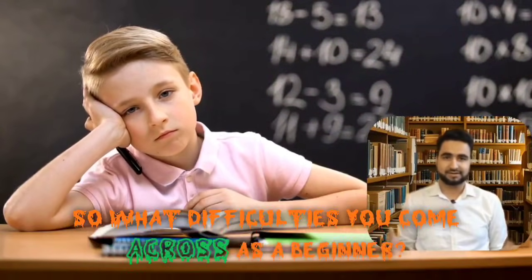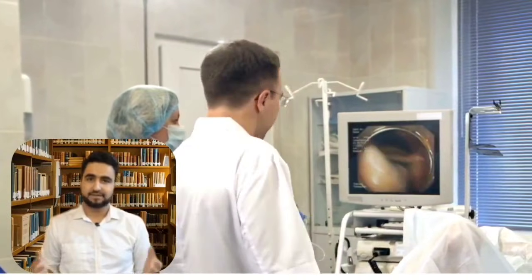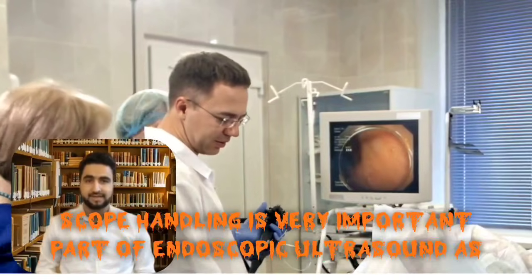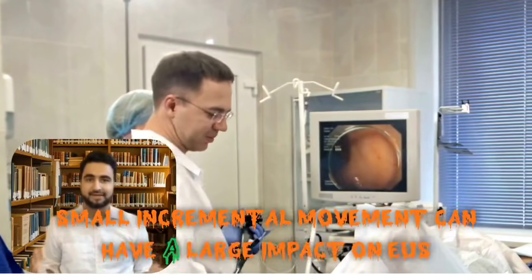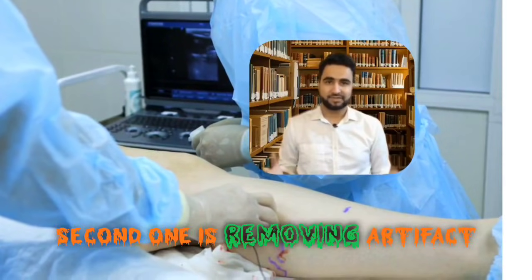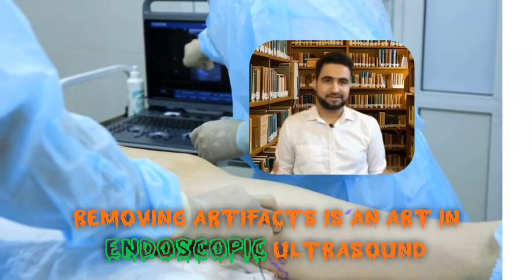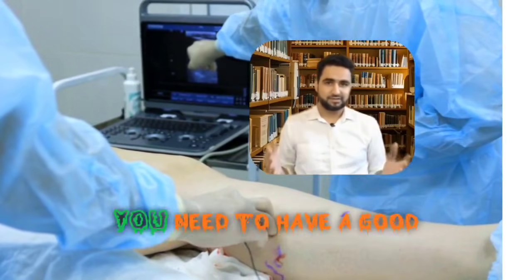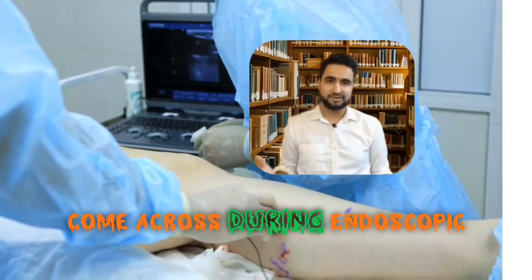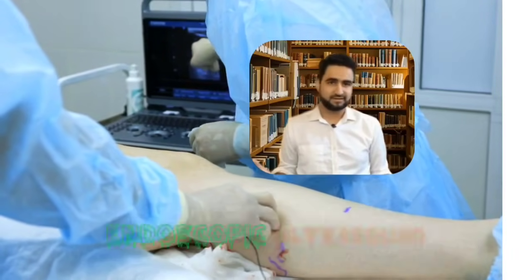What difficulties do you come across as a beginner? The first one is scope handling. Scope handling is a very important part of endoscopic ultrasound, as small incremental movements can have a large impact on the EUS image. The second difficulty is removing artifacts. Removing artifacts is an art in endoscopic ultrasound, and for learning this art you need a good knowledge of the artifacts you may encounter. There will be a separate presentation on artifacts in EUS.